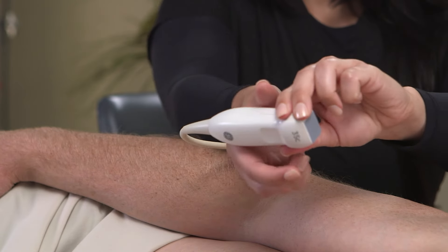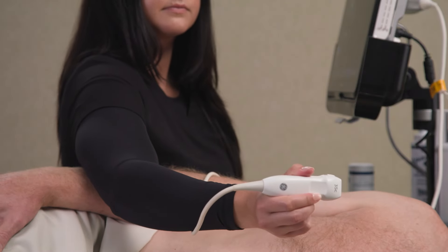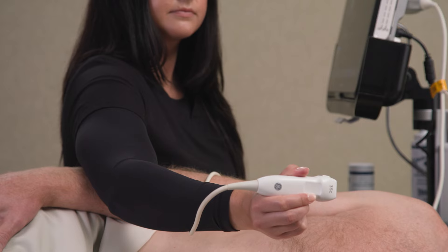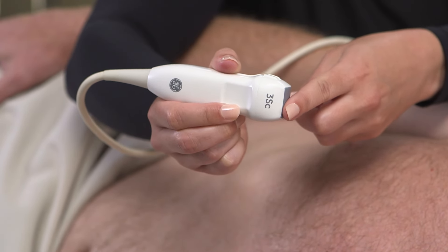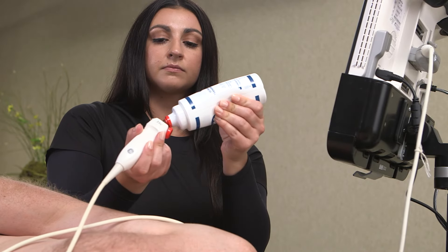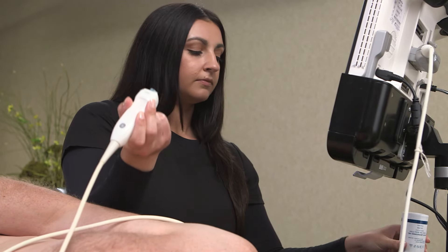When holding the probe, you want to hold it like you would a pencil, loosely with your thumb on one side and your second and middle fingers on the other. Make sure to grip the probe close to the face for added stability and increased control. This will allow you to make large and small movements.